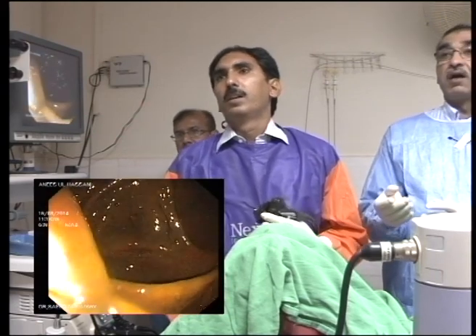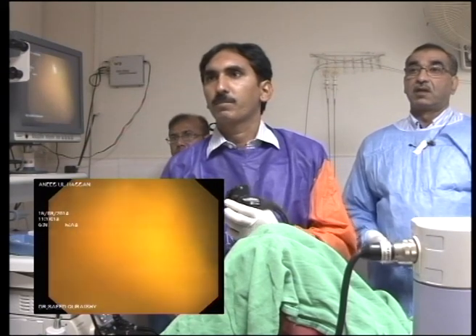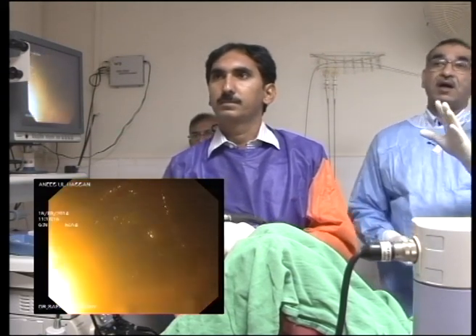But we can see the appendicular orifice opening very clearly. And the ileocecal valve at 9 o'clock, we saw the ileocecal valve even before. So you're now going to try and get into the terminal ileum?